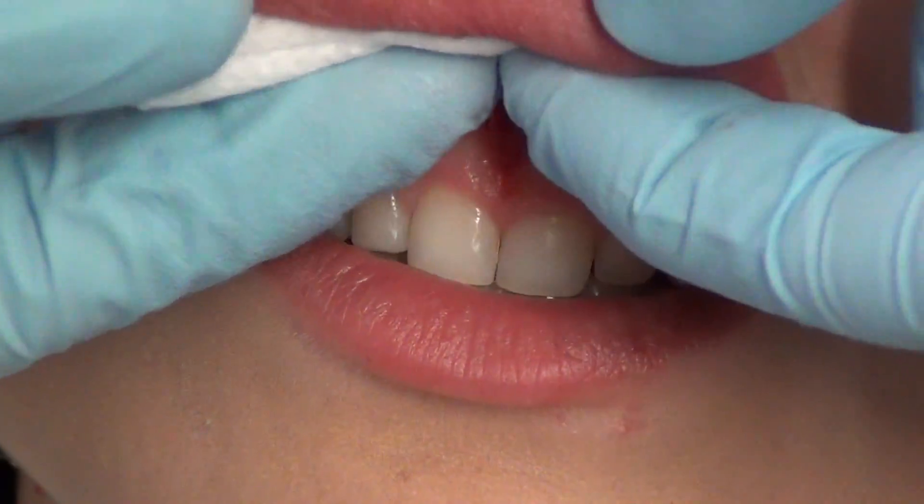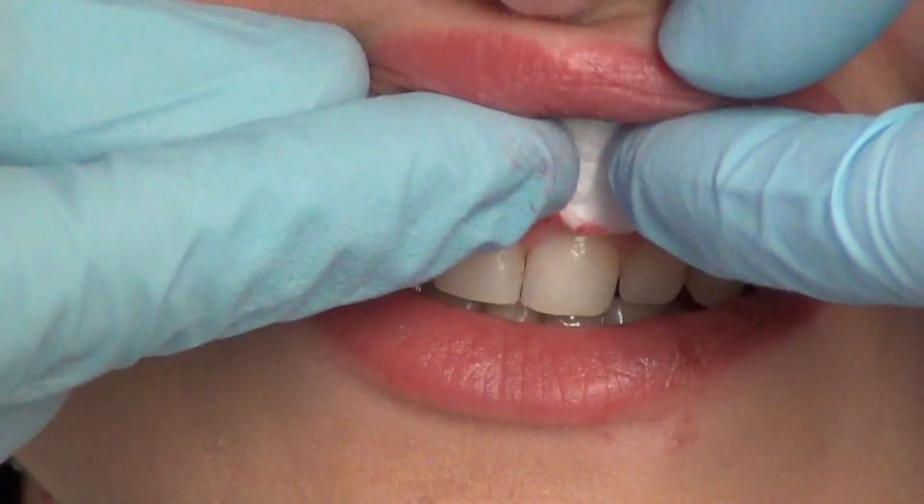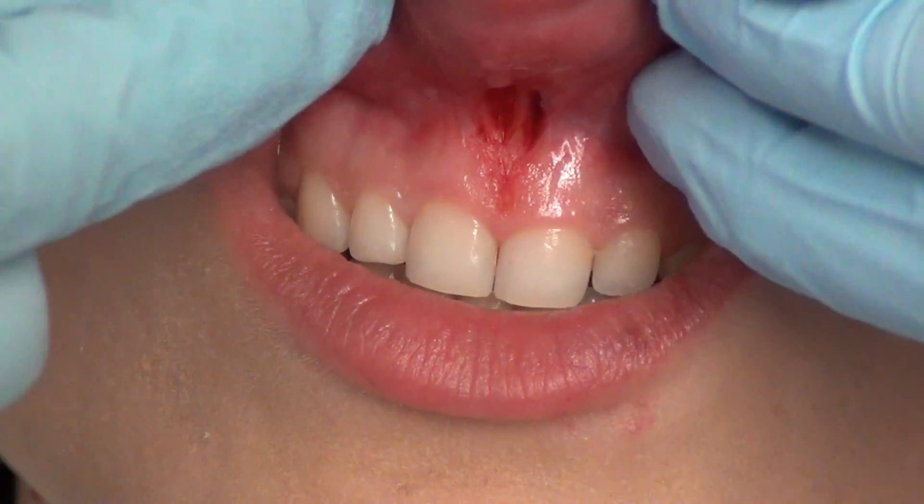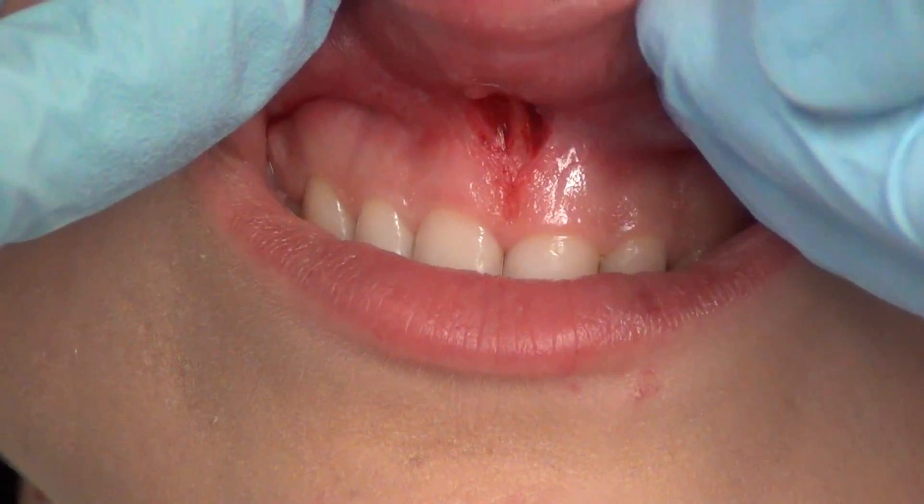Just massage me a little bit. It's gonna pretty much close up that hole, okay.